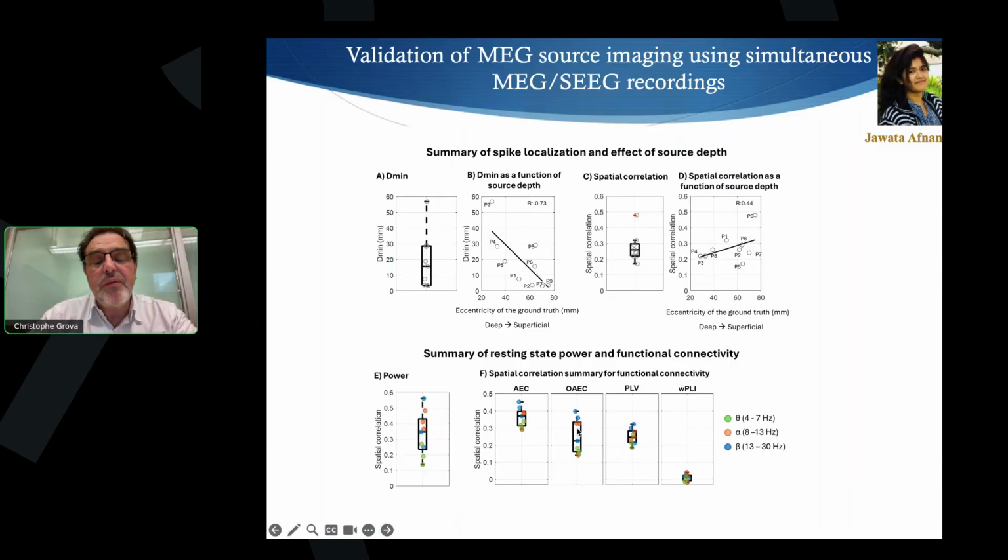And when we were comparing functional connectivity directly in SEEG or from MEG converted to SEEG, it was quite good for those two metrics that are sensitive to the leakage. But when you remove the effect of zero lag leakage, then you reduce the value, but amplitude envelope correlation still shows good value. But when doing connectivity during pure resting state, WPLI was probably not an appropriate metric to study that.